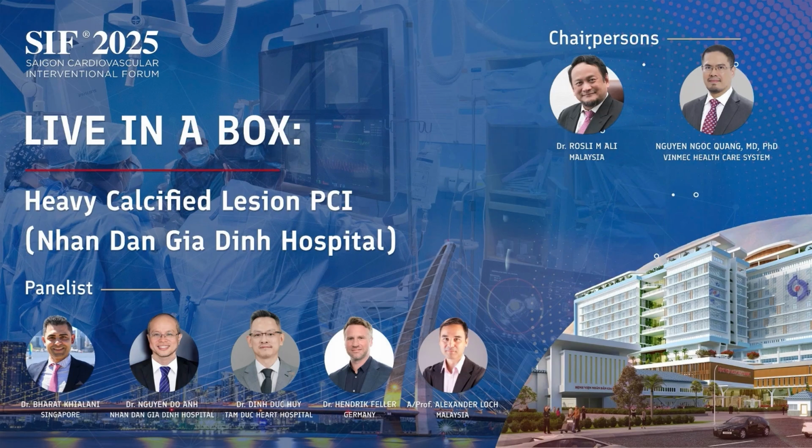On our side, I think we can see that OCT gives beautiful images, especially with calcium, isn't it? But I'm more used to IVUS, so I tend to use more IVUS than OCT. Now that we have got injectors, I'm trying to use more OCT because the images are going to be quite good, since it depends so much on how you inject and the lesion proximal to it. On our side, this is a case where we will probably use Lithix mechanical IVL. With Shockwave IVL, as I agree with Hendrik, you have to use multiple and it's going to be more costly. It's only going to be limited to 80 to 120 pulses depending.